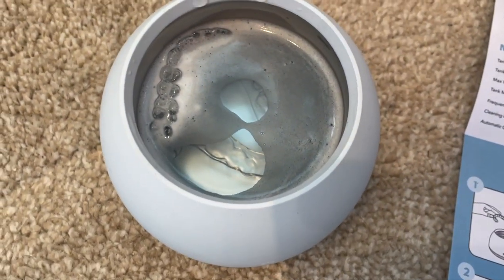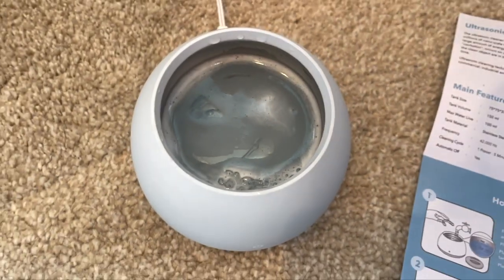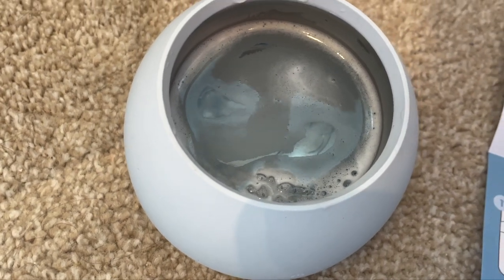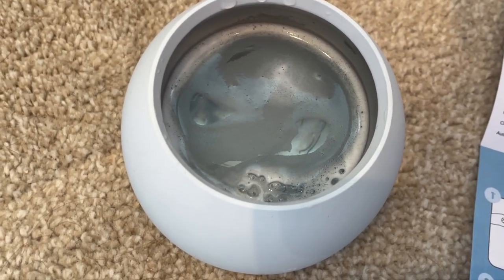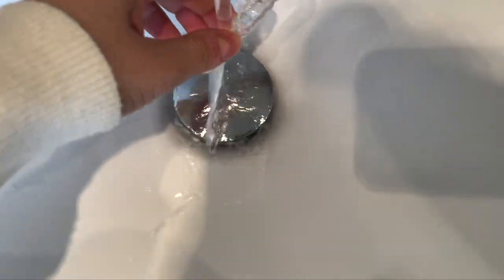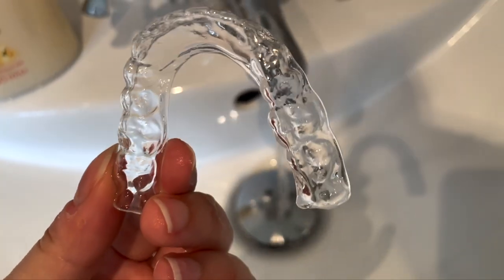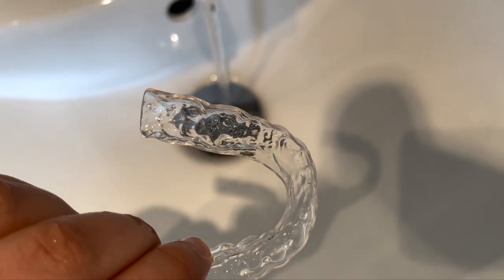You can see the tablet has fully dissolved. One thing I have noticed with the Dental Pod is that if you use cold water the tablet doesn't fully dissolve, so I'd always recommend you use slightly warmer water — then you'll notice there are no remnants left of the tablet at the end of your five minutes. We're now going to empty this out into the sink and see what the retainers look like — crystal clear, very very happy with that.